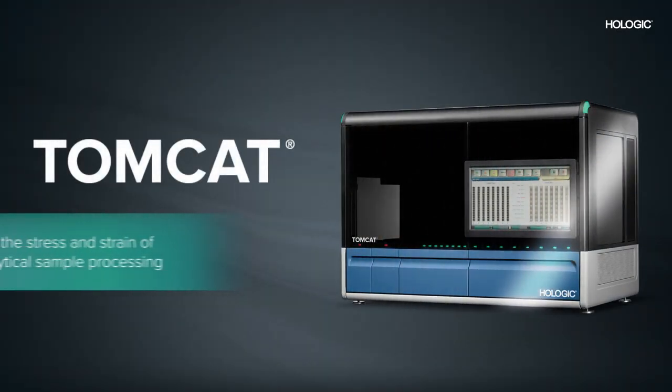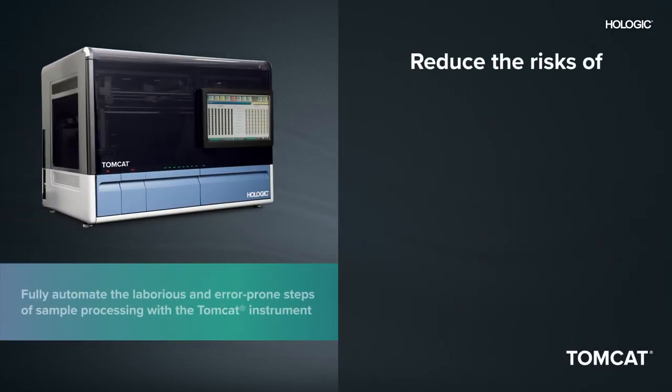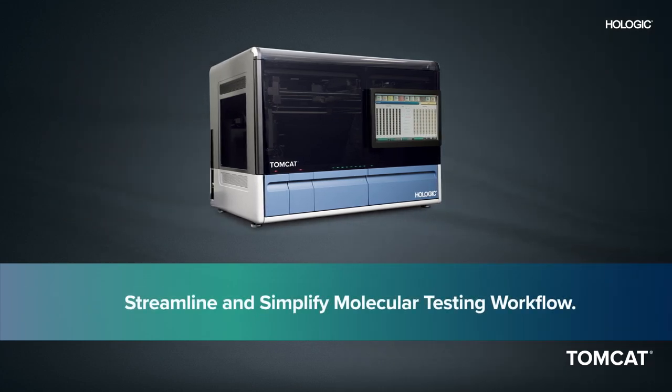Remove the stress and strain of pre-analytical sample processing with the Tomcat instrument from Hologic. With the Tomcat instrument, you're able to fully automate laborious and error-prone steps associated with sample preparation, allowing you to streamline and simplify your molecular testing workflow.